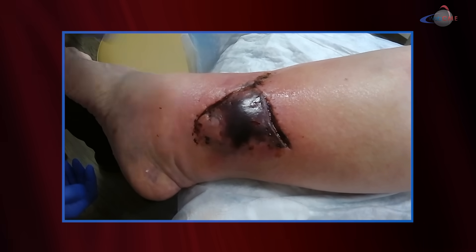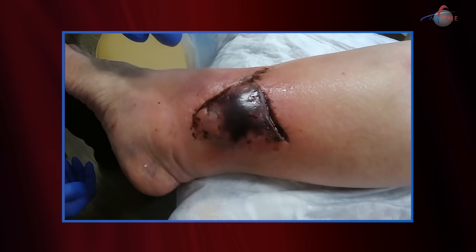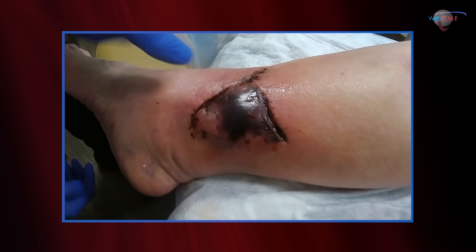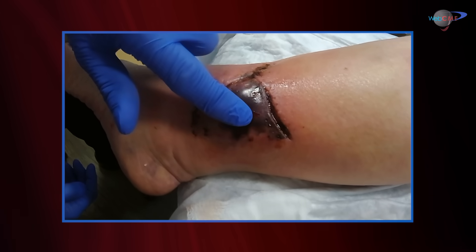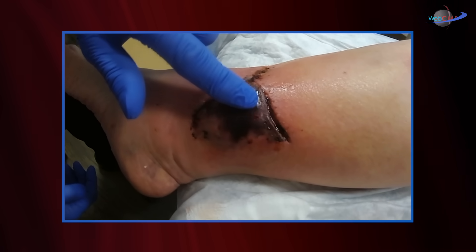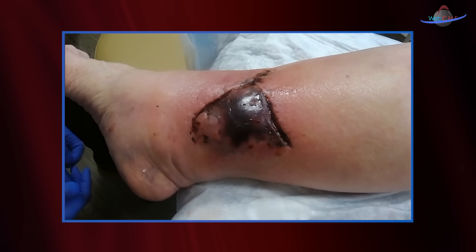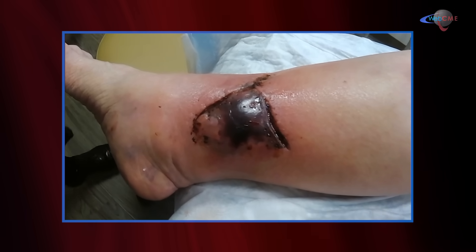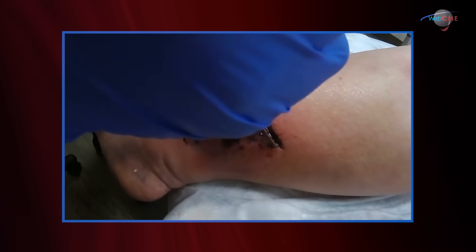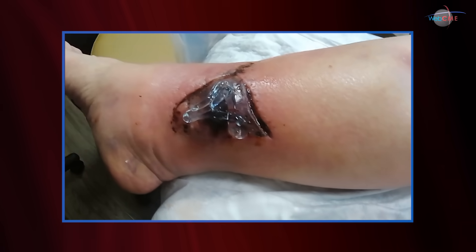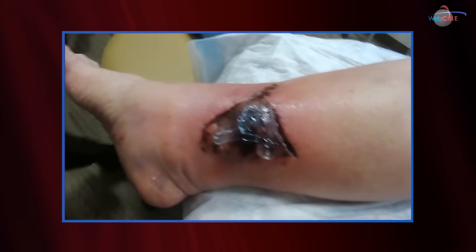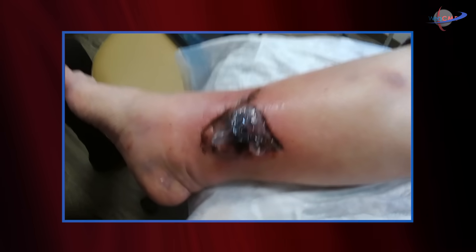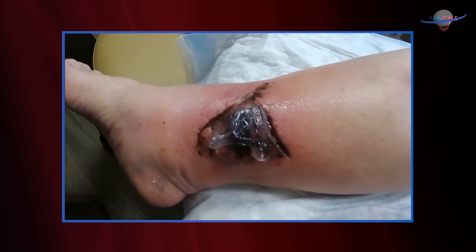How do we evaluate this? We can do it clinically by just looking at the wound — I can feel a little bit of fluctuance in this area. However, a better way is to use ultrasound, and we're going to demonstrate that today. We'll apply a little sterile ultrasound gel on the wound and then take the ultrasound probe and actually image it.